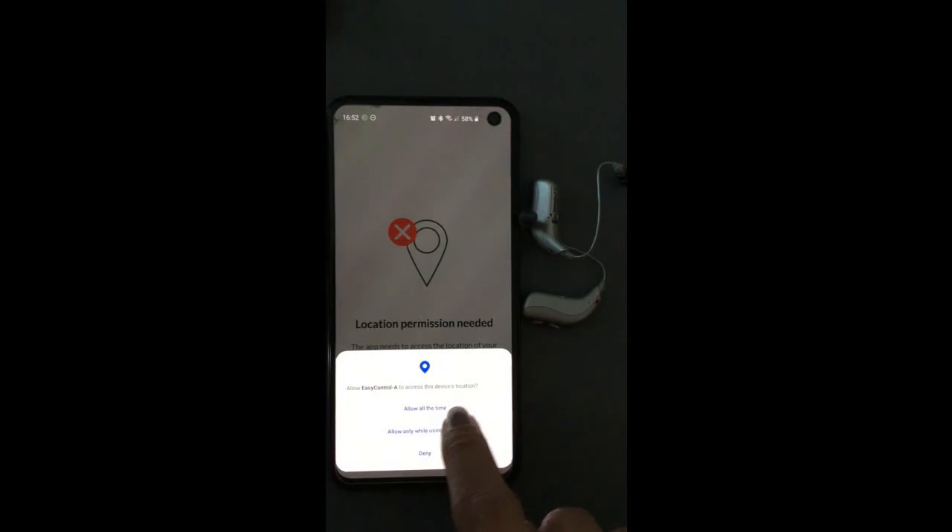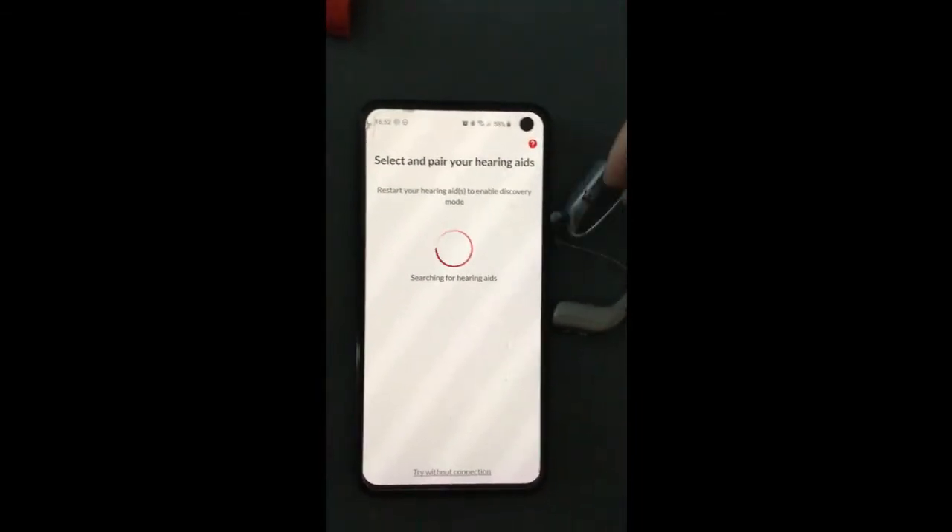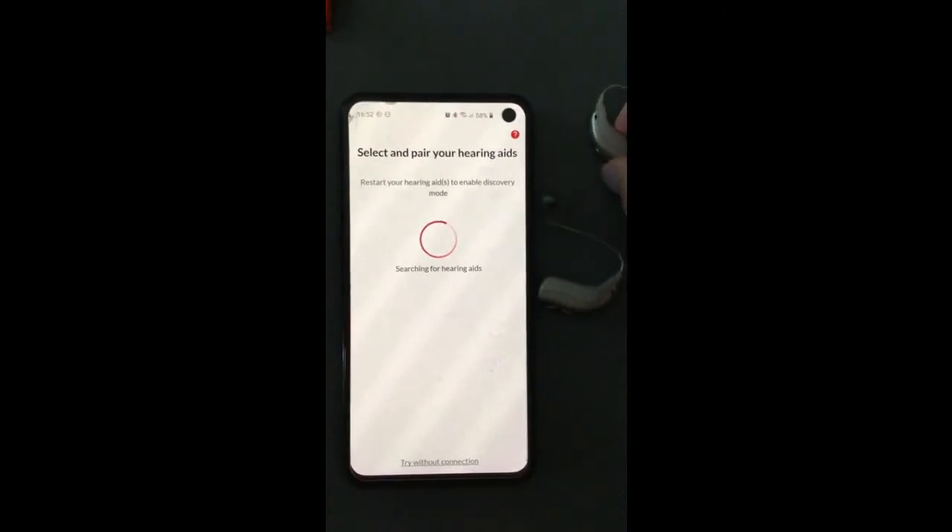We're first going to select 'allow all the time' so that if you misplace your hearing aids, the app will be able to locate them.